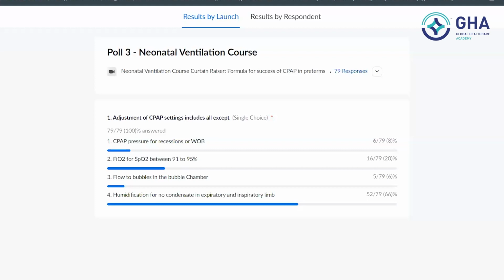Next. Yeah, the last one, for a baby on CPAP with low hypoxia and retractions, always open the lung, keep the lung open. If the lung is open, retractions are going to be minimal or nil.